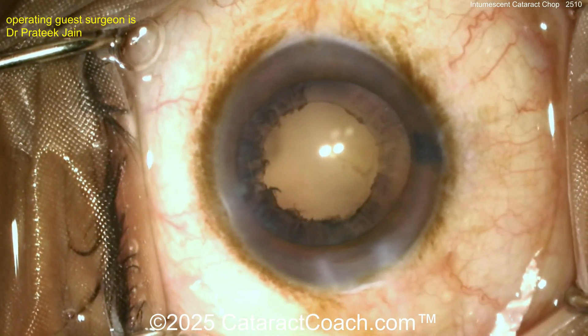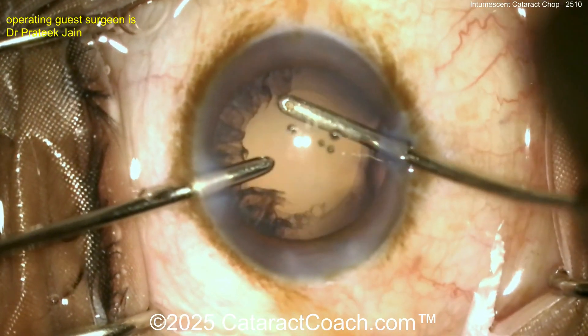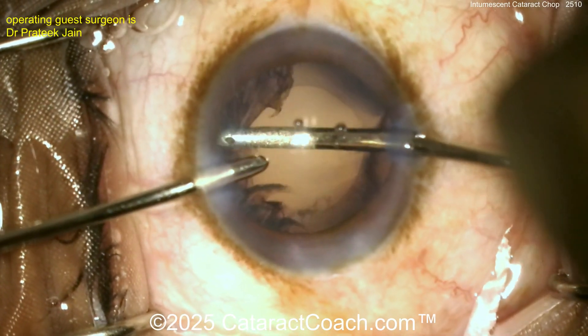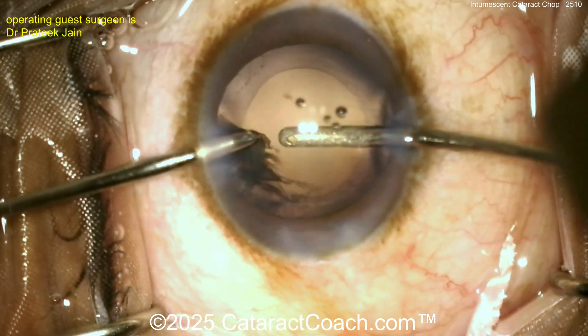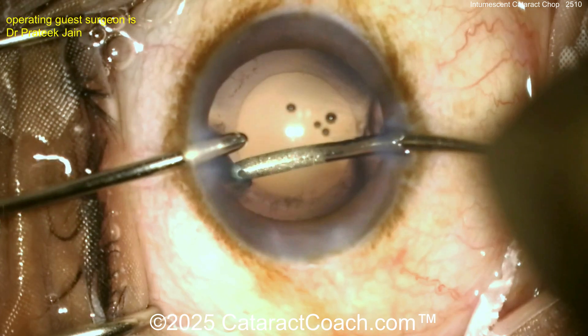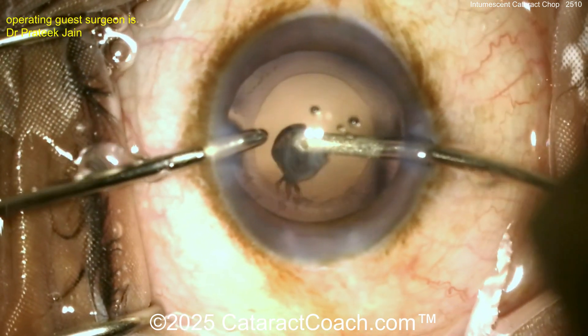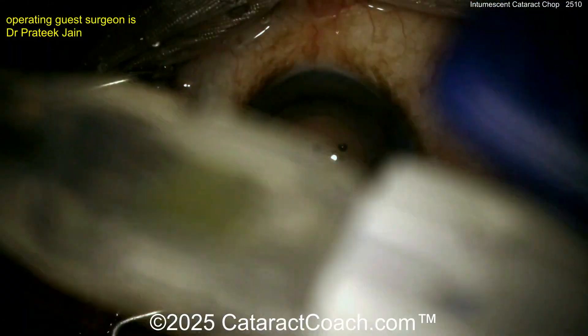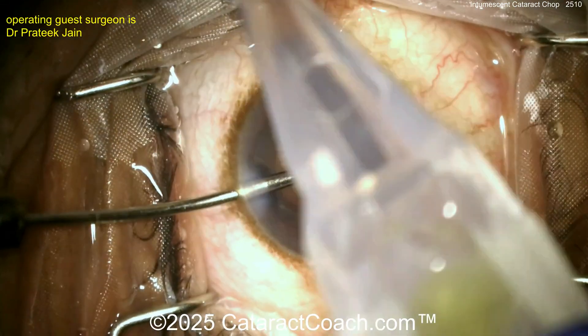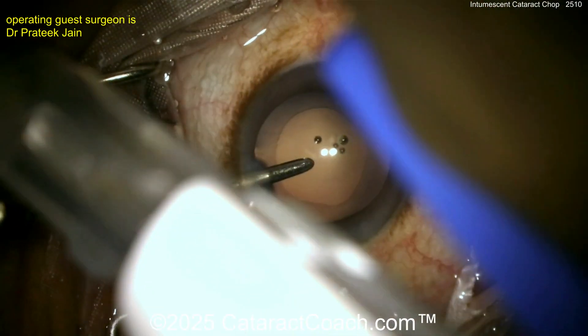Now let's clean up that cortex with the IA probe and we'll get the lens in the eye. Here's the bimanual IA, nicely done, cleaning that up. It's interesting — in the US bimanual IA is not very common. The vast majority of US surgeons use a coaxial IA system, whereas in other countries it's a lot more common to use bimanual IA.